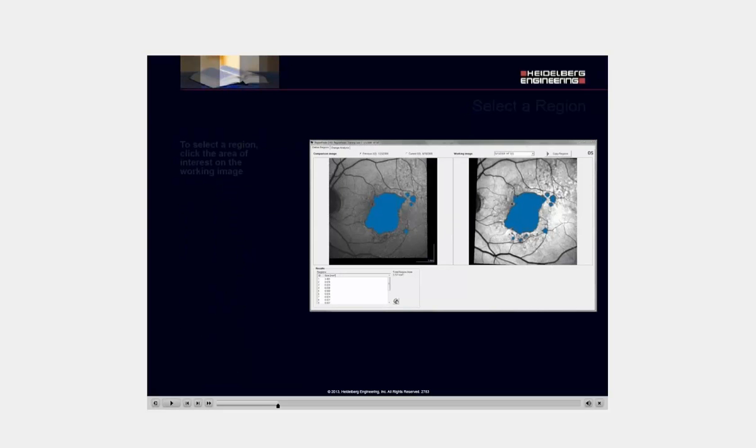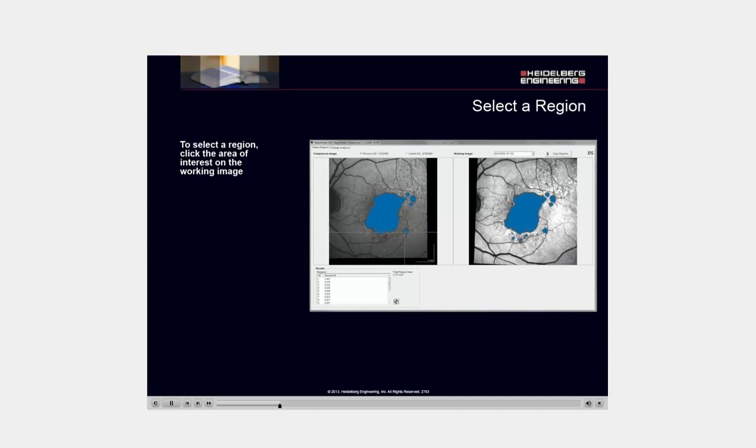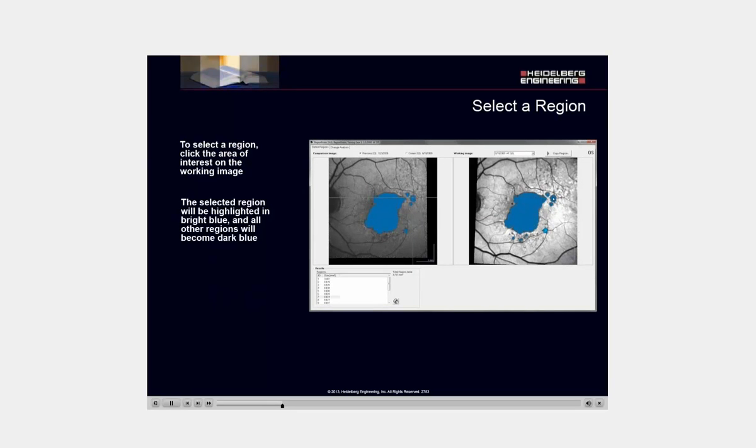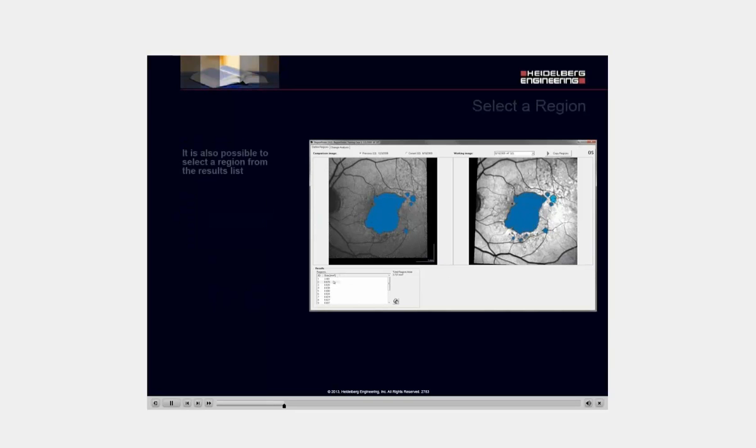To select a region, click the area of interest on the working image. The selected region will be highlighted in bright blue, and all other regions will become dark blue. It is also possible to select a region from the results list.